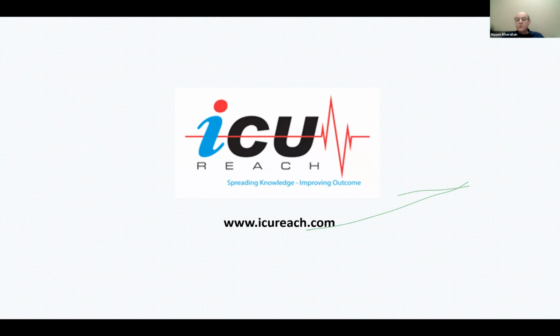So you can see that most of you got the right answer. Everything is correct here. So on the ventilator, this is what you need to do. Whatever method you have, you can combine these methods together. Ventilator pressure and flow, that's for sure, in every single patient, depending of course on the mode of ventilation, whether you're controlling the pressure or the volume. Esophageal pressure monitoring, if you have it. Luckily, we have that in our ICU. Inspiratory and expiratory occlusion pressures, as we talked about. This is very simple. You can do it on any ventilator. You can do it tomorrow on your patient.